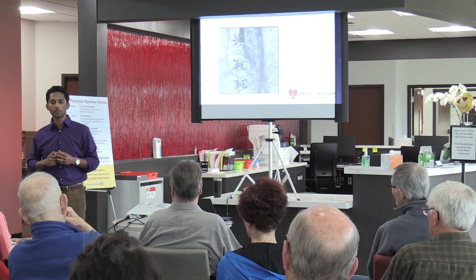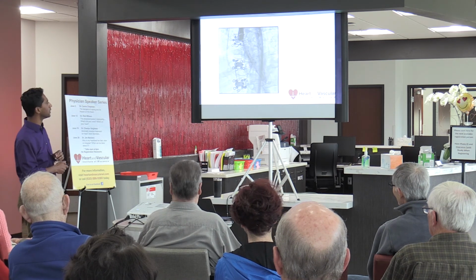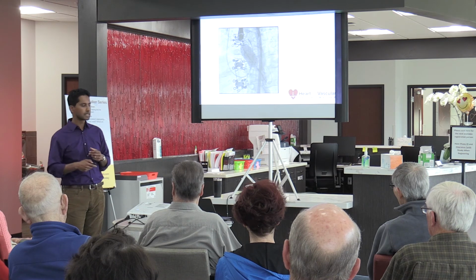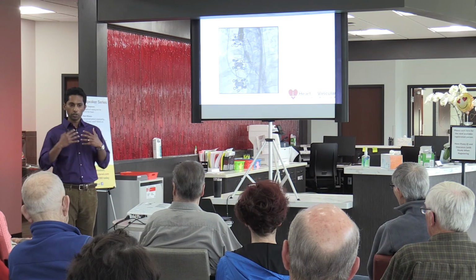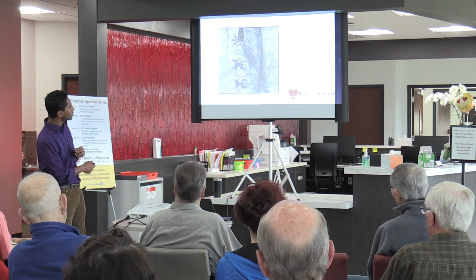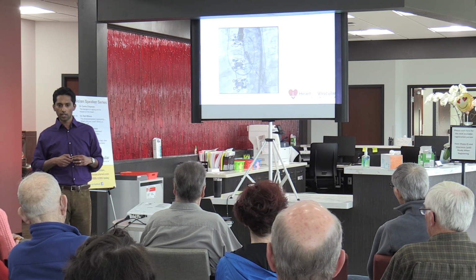What are those three things in there? I didn't do that. This person had open heart surgery before, which is part of the reason they couldn't go back to get the valve replaced surgically, because they didn't want to go back in a second time. These are essentially sternal closure devices. When they open the breastbone and close it back again, some folks use these devices to hold that bone together. But this made for a very spicy procedure because we couldn't see around it very easily. So we had to finagle an angle where we could actually see the valve and the work that we were doing.